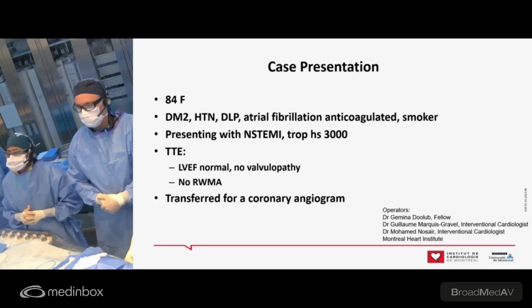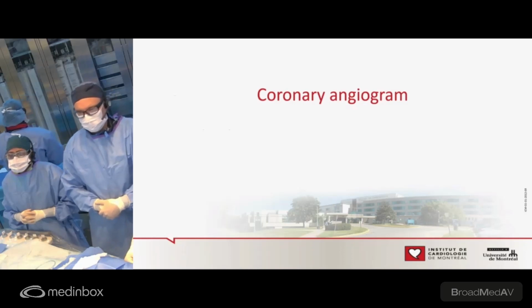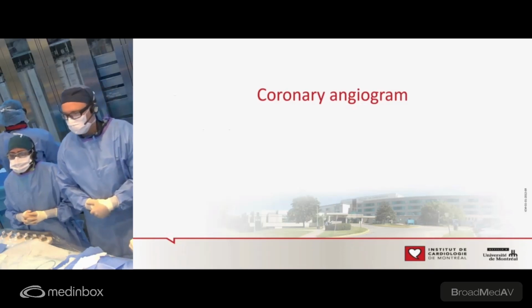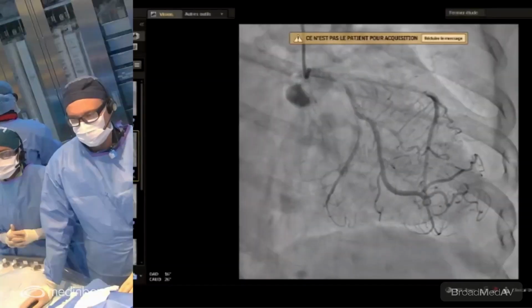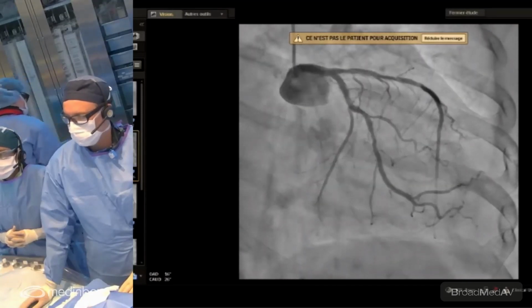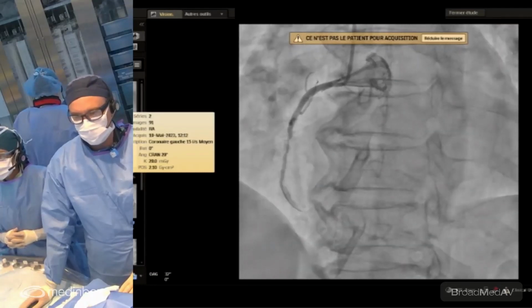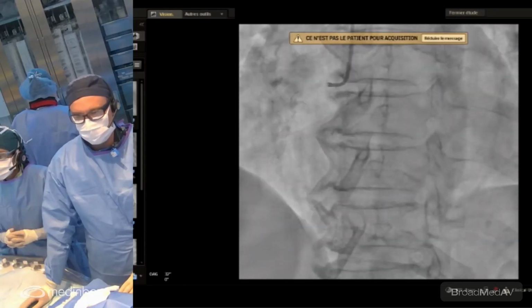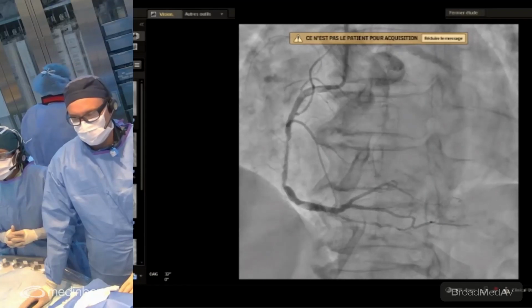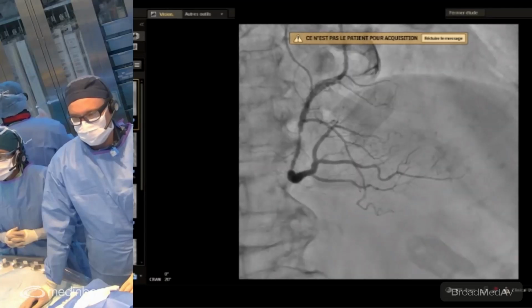Can you show the next slide? The first shot was a shot of the right. Can you show the angio, please? Can you go to the PACS images? Can you show the right first? Perfect. So there's a severe disease of the mid RCA. There's a long segment with moderate to severe calcification, about a 70–90% stenosis. This is the right dominant artery. Can you show the next one?